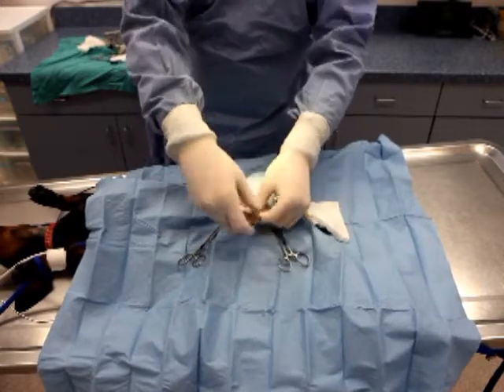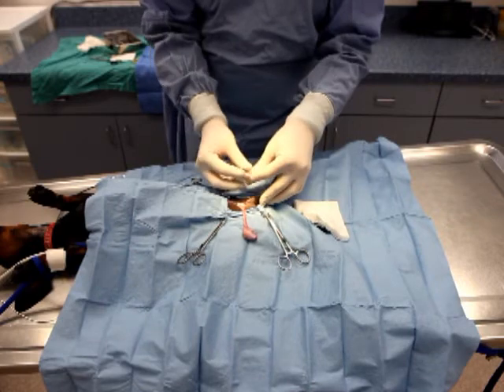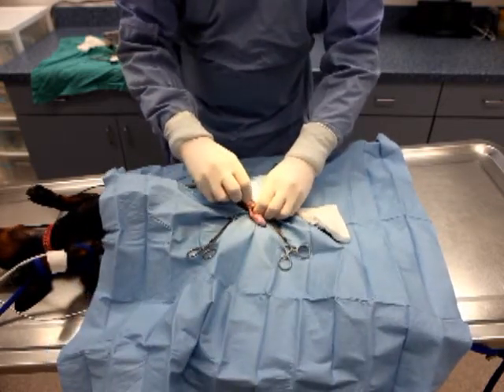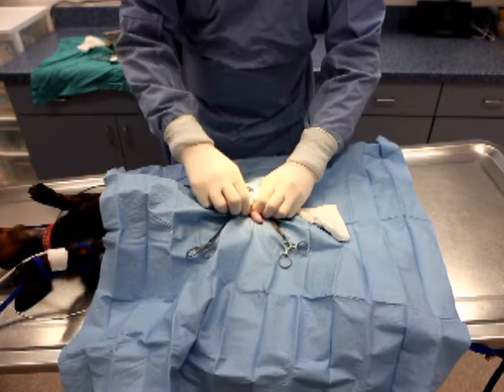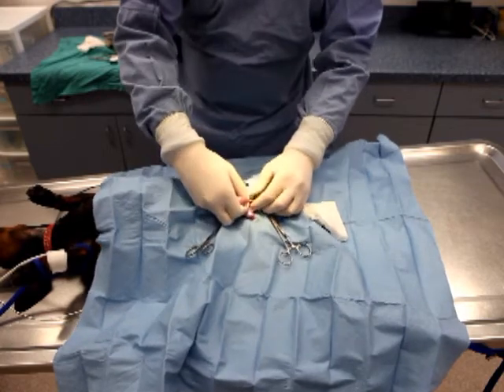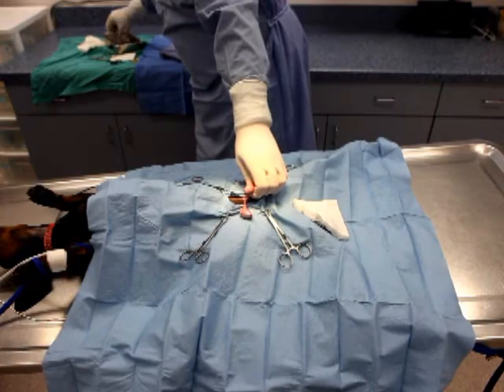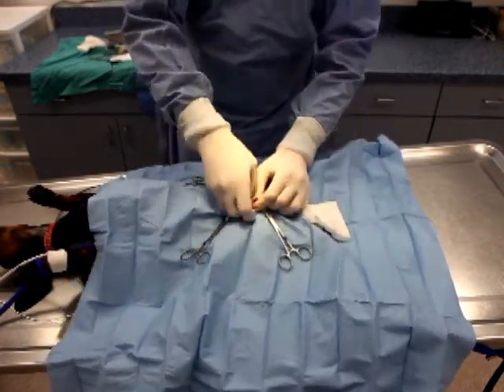We have found it to be more efficient to exteriorize both testicles at the same time versus separately. You will notice that the surgeon in the video inadvertently creates an open castration. In the event that this occurs, simply grab a hemostat from the surgery pack and place it just below the testicle in the area where the vaginal tunic remains, and then proceed with the castration procedure.